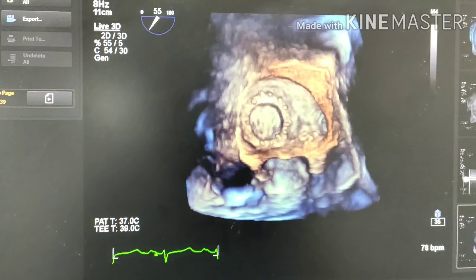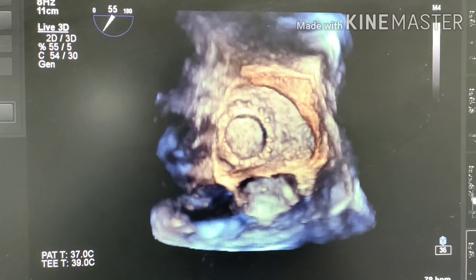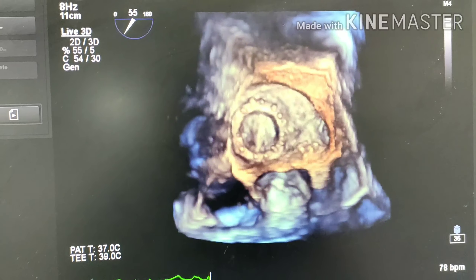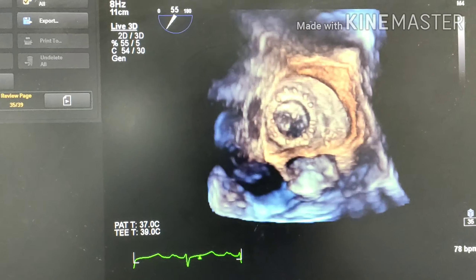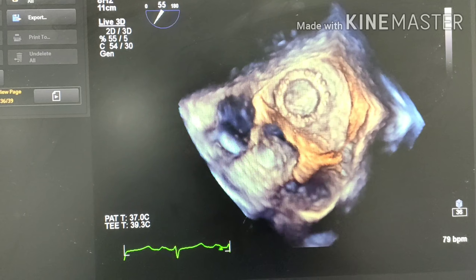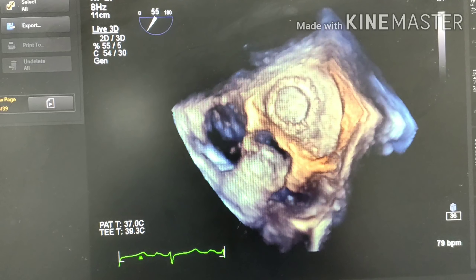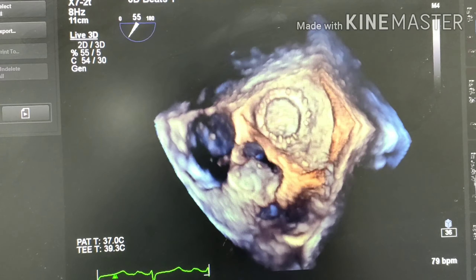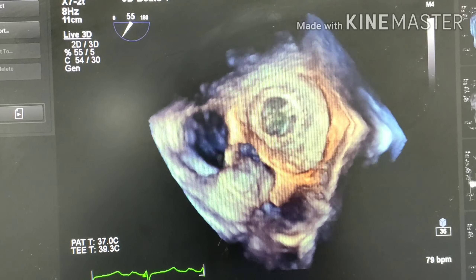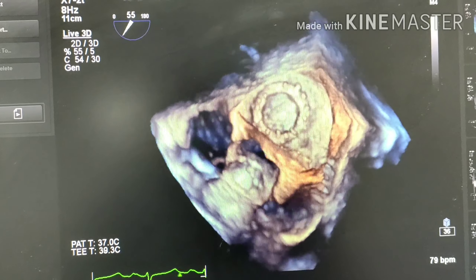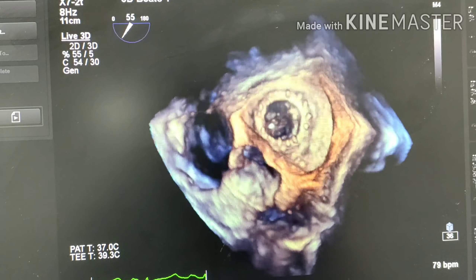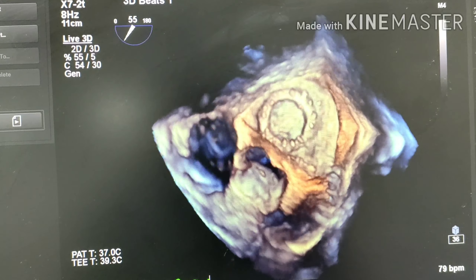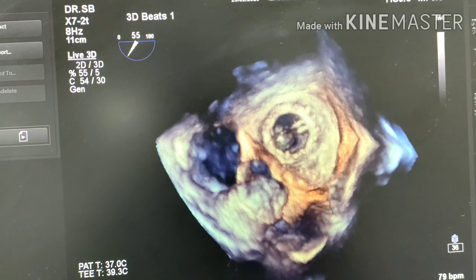One more good view — you can beautifully see the two leaflets opening and closing. So we can confirm that this patient had rheumatic mitral stenosis and received a bileaflet mechanical valve. With our assessment using both 2D and 3D, this patient has a normally functioning bileaflet mechanical valve without any complications. Thank you.